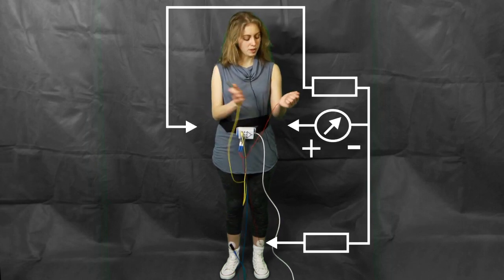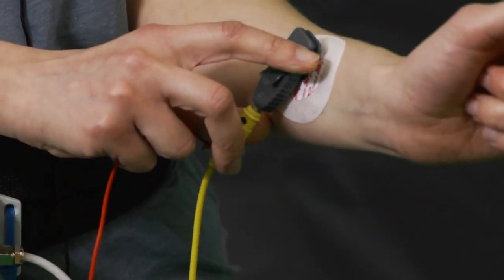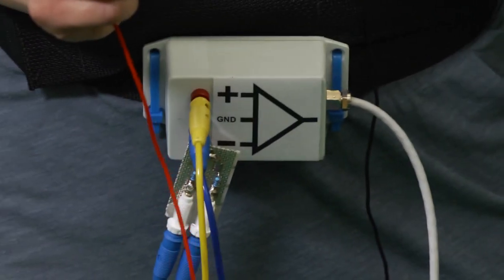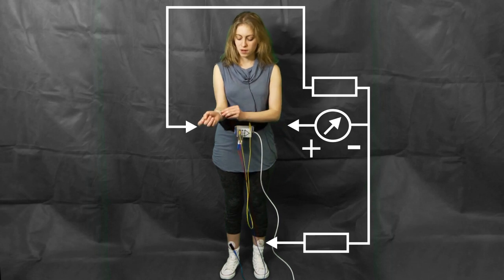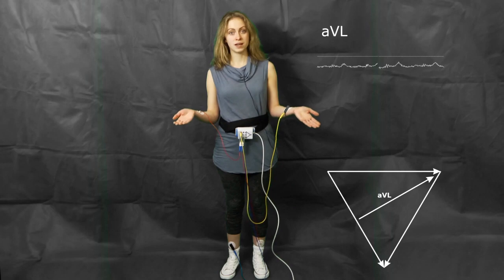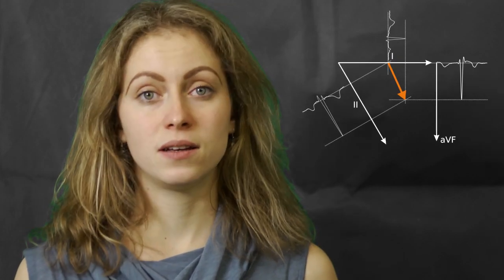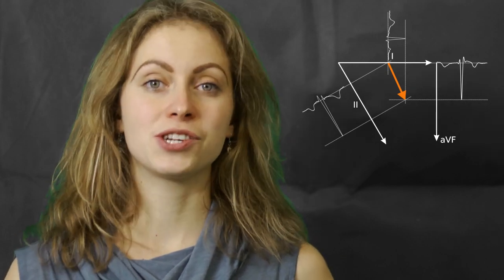We take the positive input and connect it to the left arm, and then the negative input from the two resistors gets connected to the remaining two limbs, left foot and right arm. There, so this is aVL. Well, in modern digital ECG machines, these leads are not measured but calculated from Eindhoven 1, 2 and 3 via trigonometric construction.